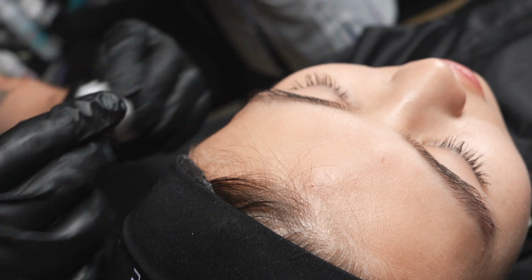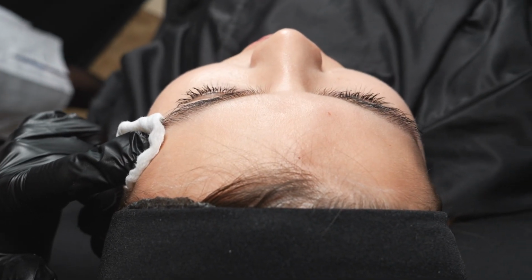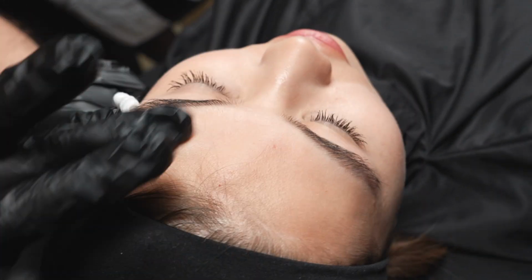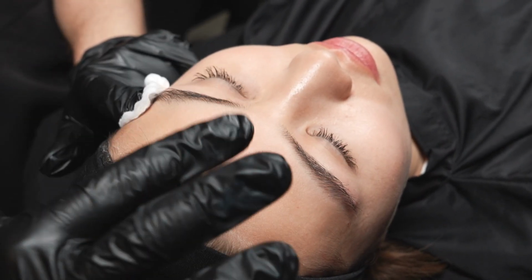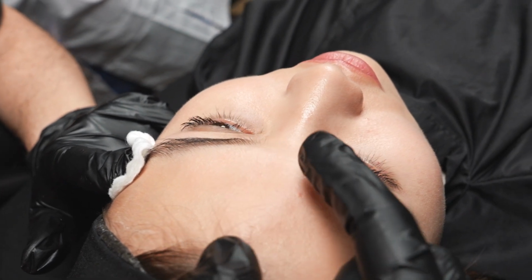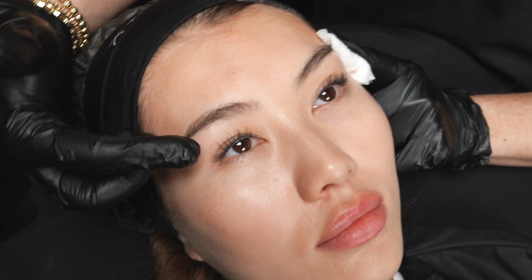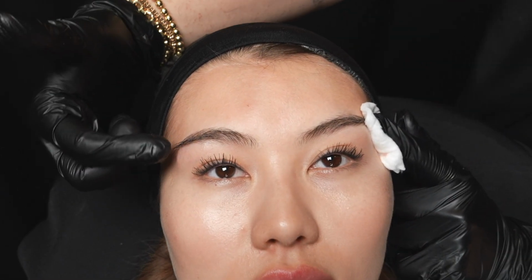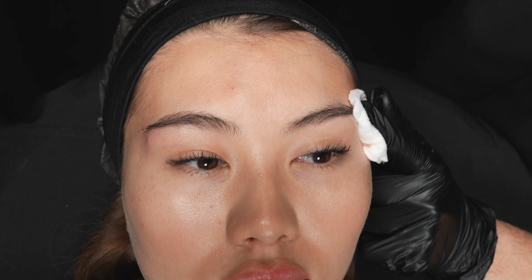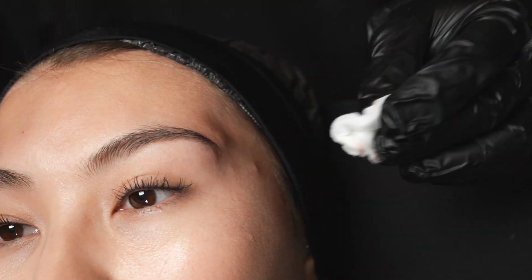Дайте, пожалуйста. Вижу, что там вена, поэтому нажму поглубже. Итак, глубокие инъекции, револьверная техника с обеих сторон, RHA 1 мл. Опять-таки глубокие инъекции под гале, 50 мм канюля, и глубокие инъекции в руф, глубоко в немобильные жировые пакеты. Опять-таки латерально работаем. И беру канюлю 25 на 38 миллиметров длиной. Не захожу в опасные зоны при этом. Вот, пожалуйста, инъекции закончены.